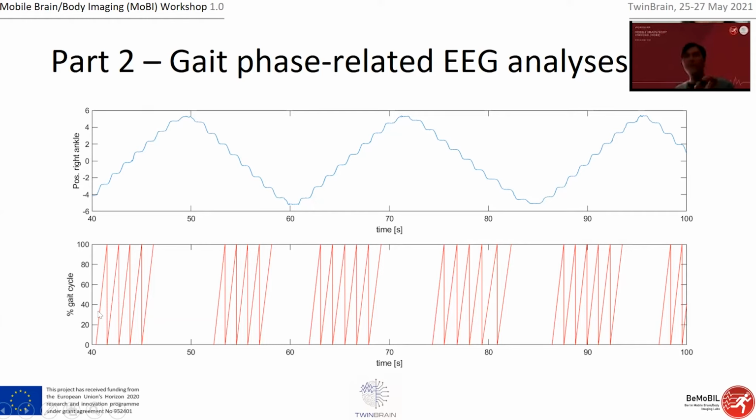That's very important for the EEG analysis, because if you average, everything has to have exactly the same timing. But here we don't have the same timing. So what do we do if we have different gait cycle lengths? We can cope by interpolating, having one gait cycle defined from right heel strike to the next right heel strike. We know this is 0 here and this is 100 here, so there must be a linear progression from 0 to 100.